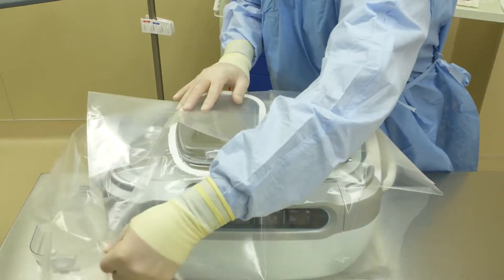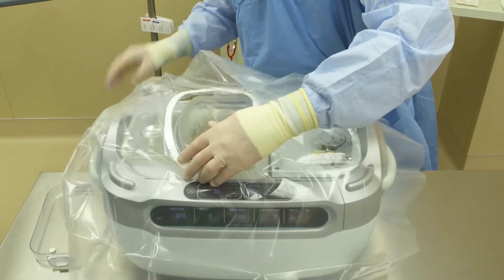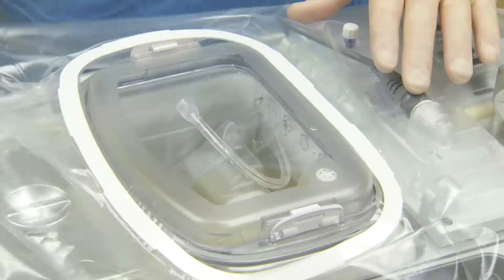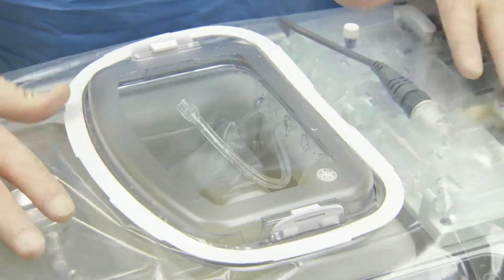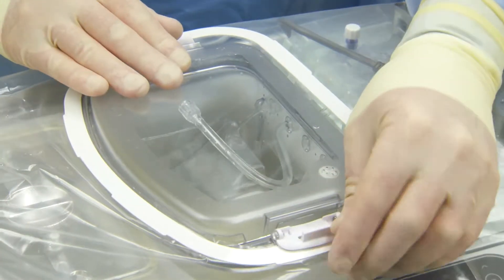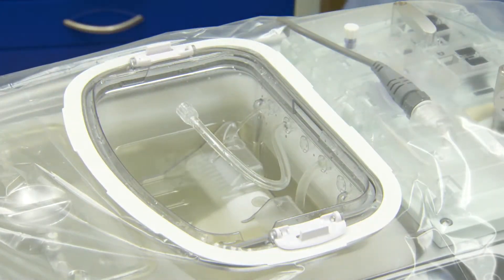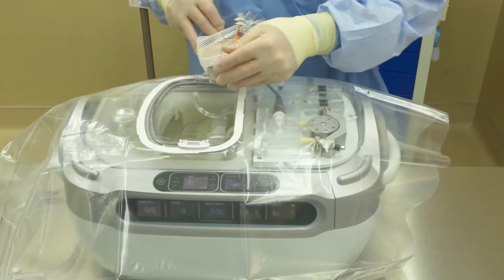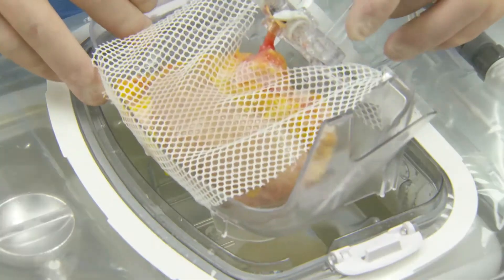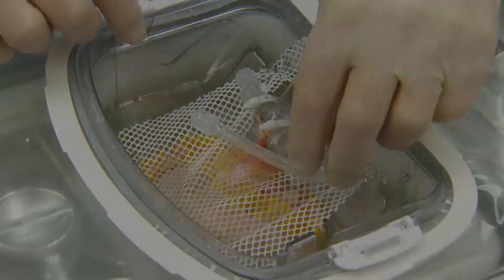Then, unfold the drape side to side. Position the drape opening around the covered perfusion circuit and remove the inner lid. You can then place the kidney cradle in the perfusion circuit and position the drape side to side.